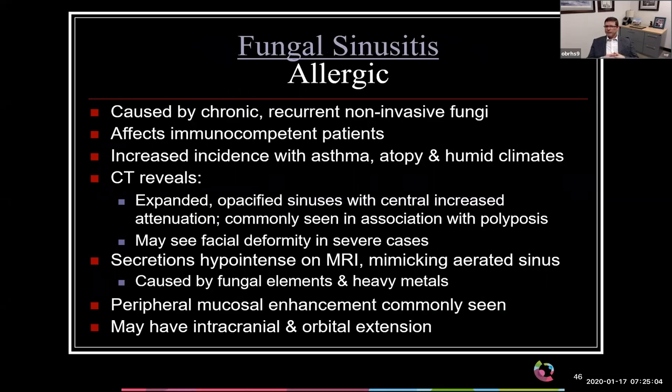So now we'll move on to fungal sinusitis, and we'll start off with allergic, which is more common, and this affects immunocompetent patients. It's more common in humid climates, and it has an increased incidence in patients with asthma and multiple allergies, and it's caused by chronic recurrent infection with non-invasive fungi. On imaging, what you're going to see is complete paranasal sinus opacification with central increased attenuation, and often those sinuses are going to be expanded. And if they're expanded significantly, they can have an associated facial deformity.